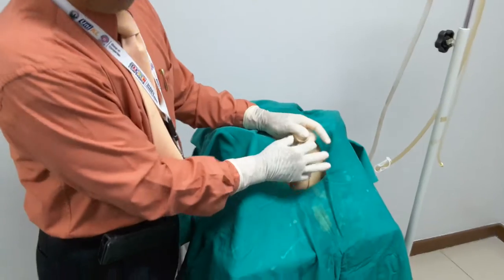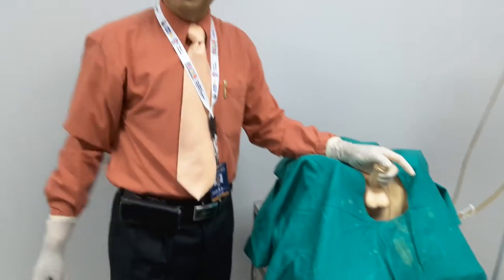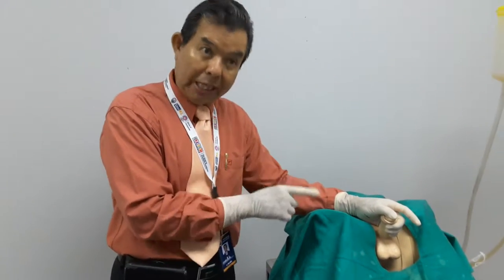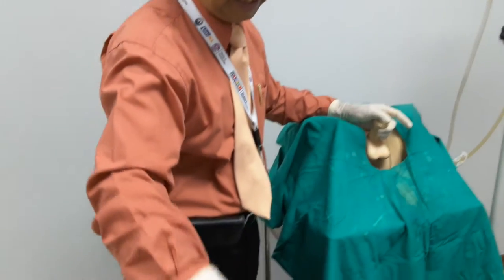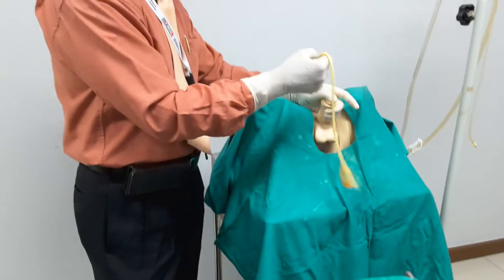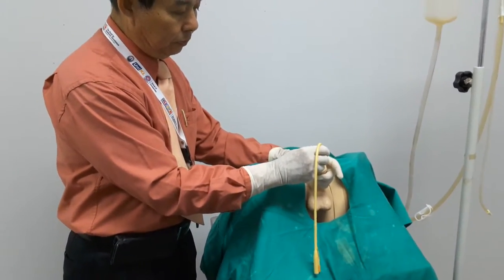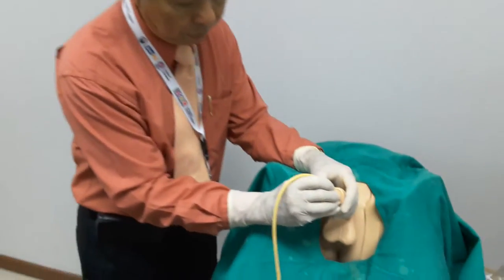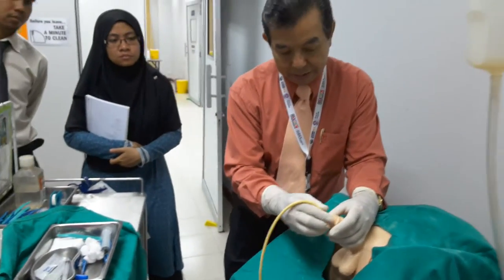We should have the stopper ready so the anesthetic gel remains inside the urethra for some time — about five to ten minutes — until it has anesthetized the area. After that, we proceed with catheter insertion.